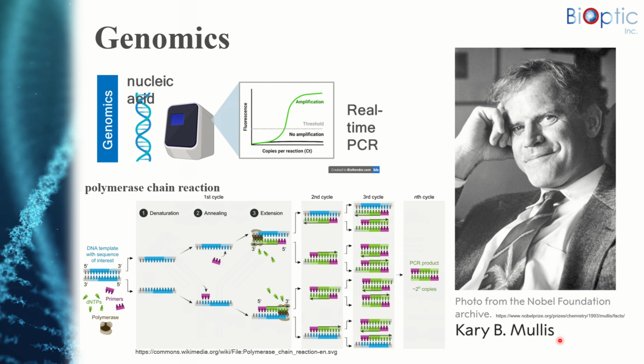The principle of PCR is to use repeated temperature rises and drops to unwind and open the double-strand DNA and let the primers anneal and then polymerase starts to work. And using PCR, copies of very small amounts of DNA sequence are exponentially amplified in a series of cycles.